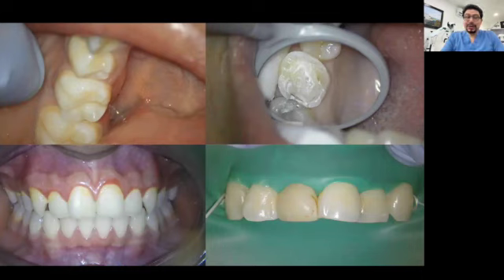Something like this happens when you change your dentistry from a regular dentistry to a clinical practice in which the microscope is helping you. You will have a better understanding of what is happening in the patient's mouth, and having that understanding will help you to have a more precise diagnostic process. And if you have a good diagnosis, of course, you will have an appropriate treatment plan. If we have a wrong diagnosis, our treatment plan will be wrong. So it's important to have all the pieces of that puzzle that the diagnosis is for reaching a good treatment plan. And then the execution of that treatment plan will be easier if we have the appropriate tools for working precisely in our patient's mouth.